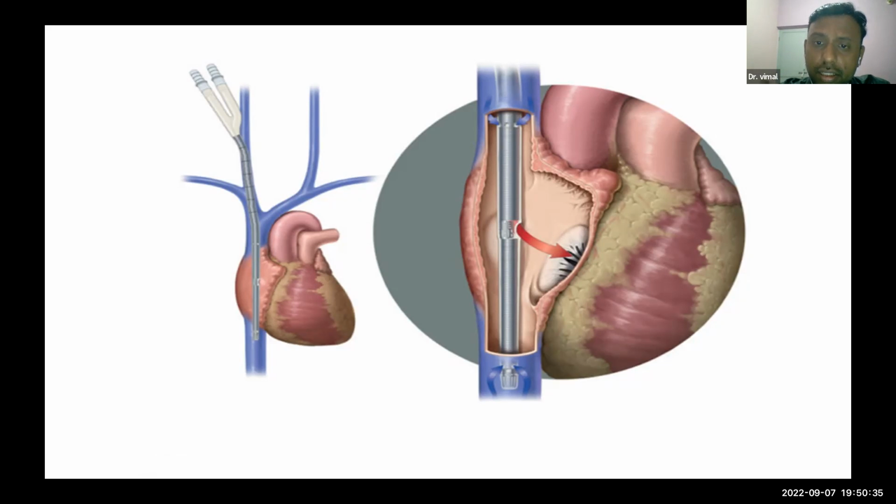So the incidence of catheter related bloodstream infections is low, and it leads to better patient comfort and aids in early mobilization as well as physiotherapy, and it is much more convenient to use. The flip side is that it is technically challenging. You need an exact alignment of the return cannula with the tricuspid valve, so fluoroscopic guidance is a must, or it can be done under transesophageal echocardiography.